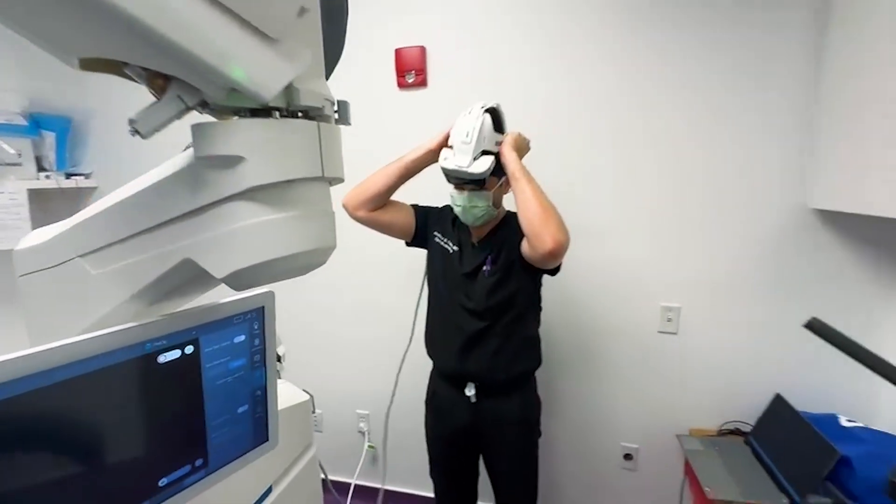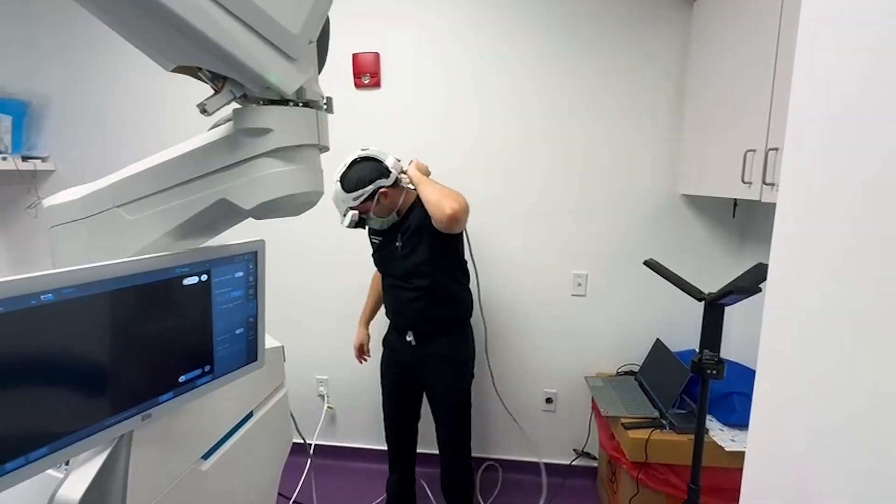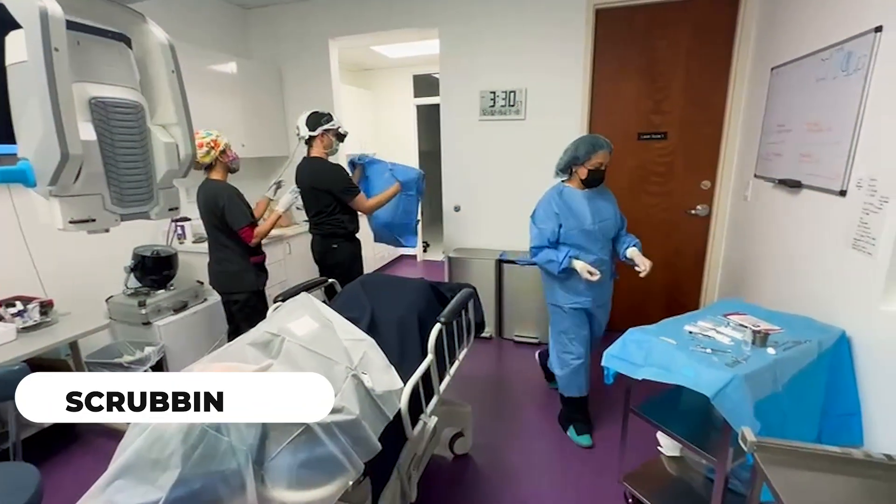This is Dr. Josh Cohen. I am getting ready to do the EVO ICL procedure. I'm going to give a quick narration of what we did for this patient.